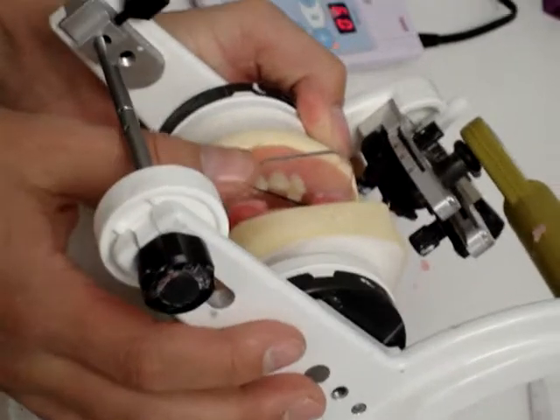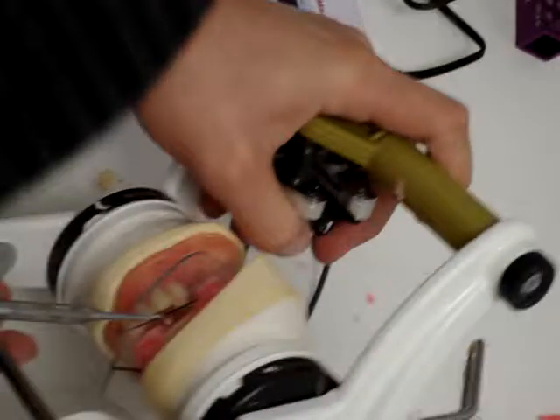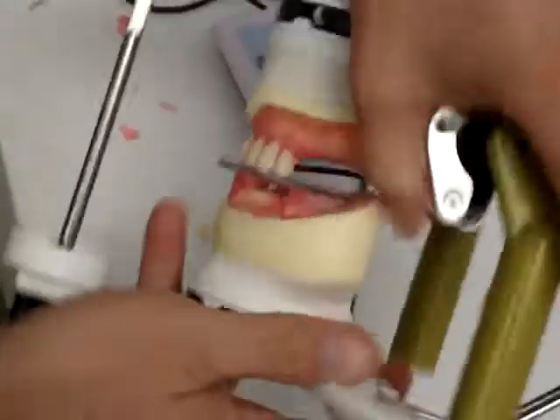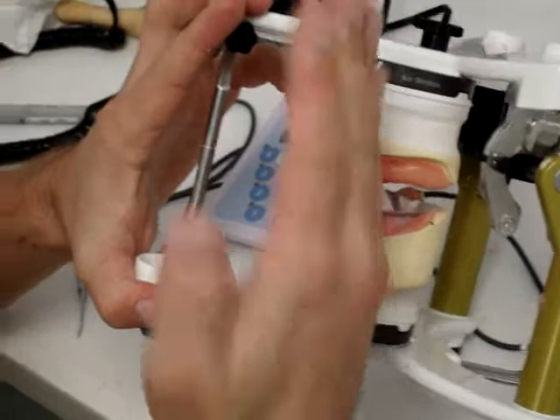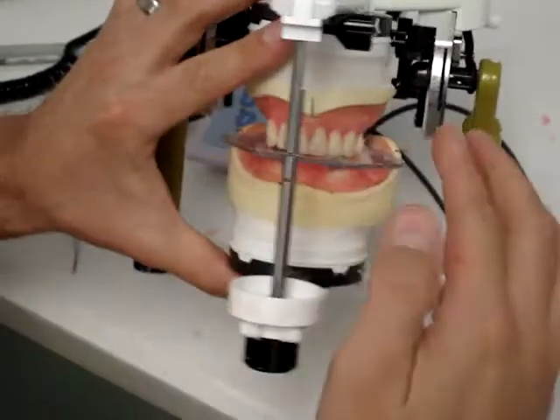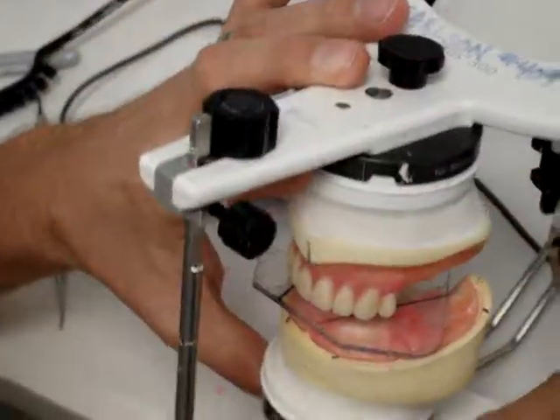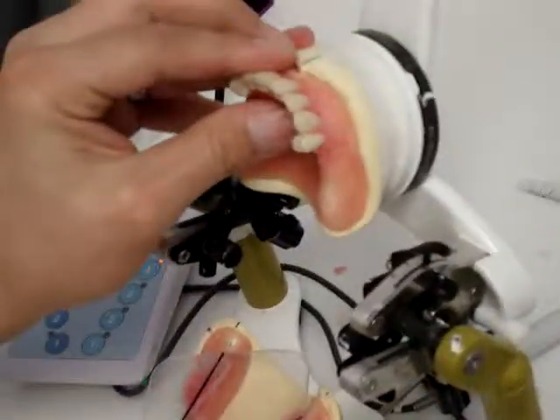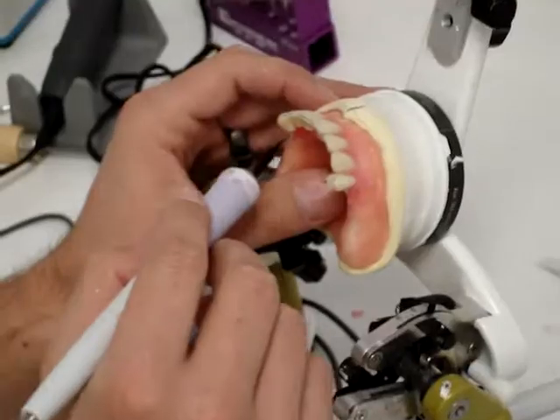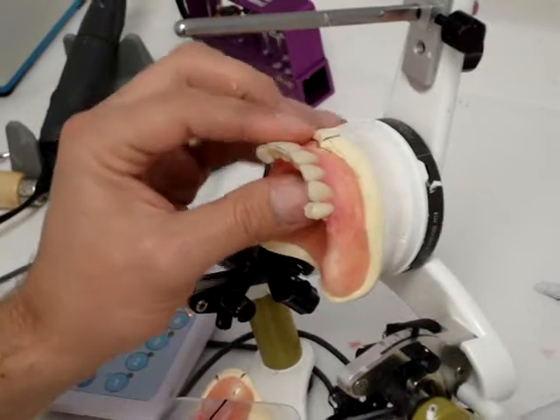That's another reason why it's important to keep this thing clean. I can see here that our dot is pretty much on that line, so I'm feeling pretty good about the position of this tooth — it's straight up and down, both cusp tips are touching the occlusal plane. Also check facially to make sure it doesn't look strange if it's too far out or too far in — you want a nice even flow. When it looks good, re-seat it. You would do this for both sides, then move on to the second premolar.